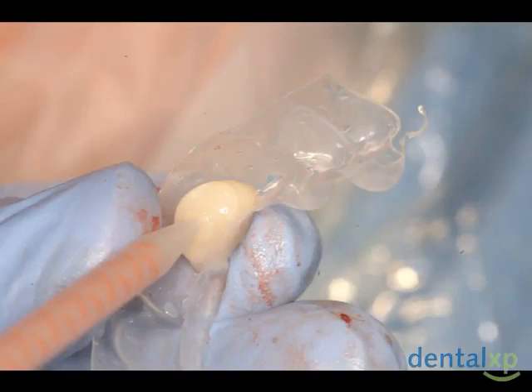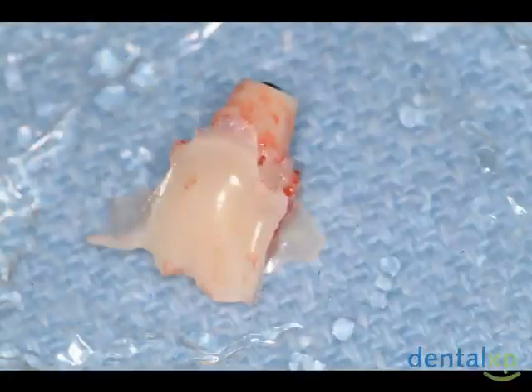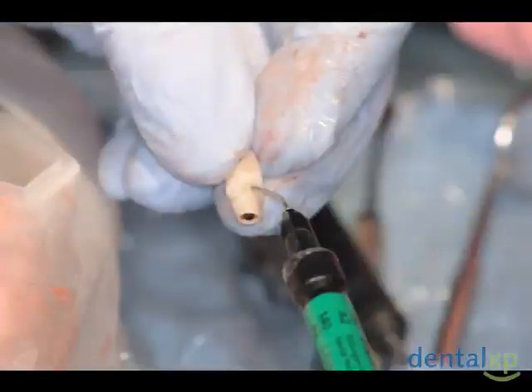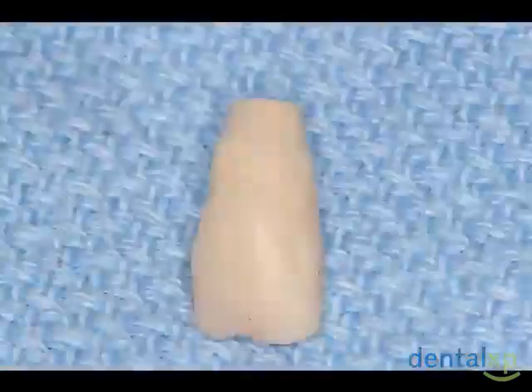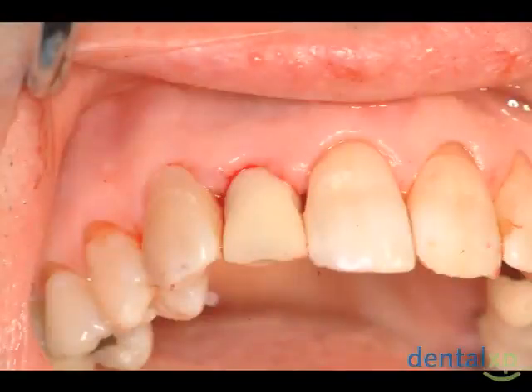Resin was placed into the stent. The stent with resin was placed over the custom provisional abutment, ensuring that the screw access hole remained open. The provisional crown was removed from the implant. Resin was added to the voids that appeared on the provisional crown. The provisional crown was then polished and placed back onto the implant.